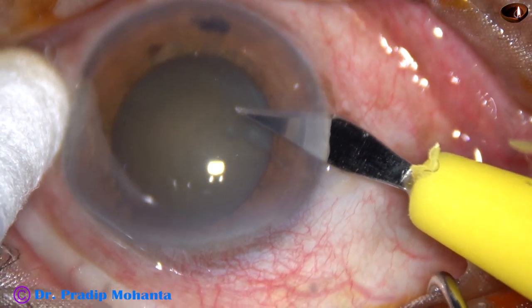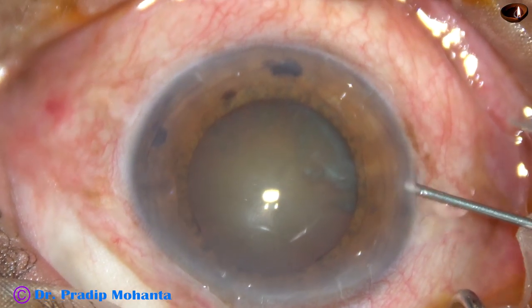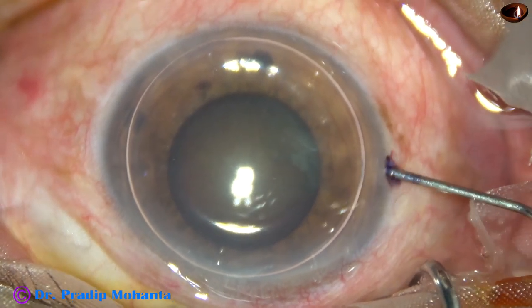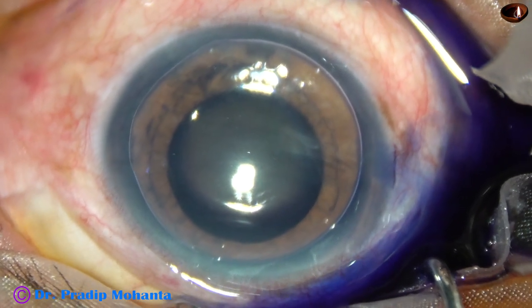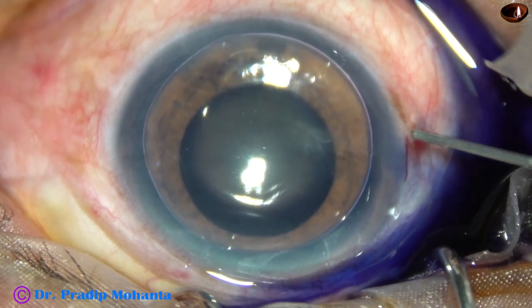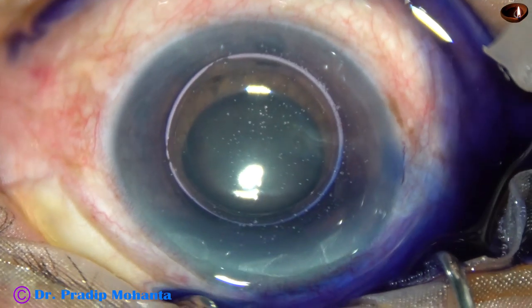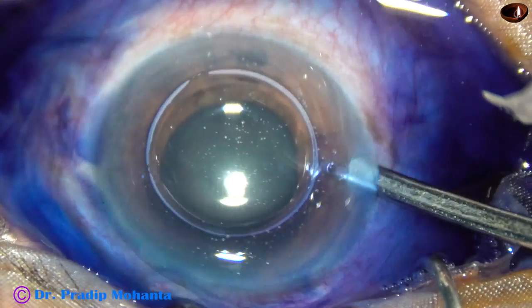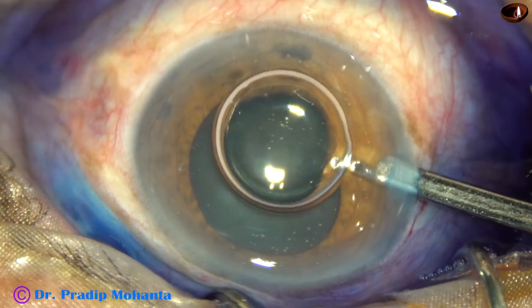This is a stab incision at around 9 o'clock. Now an air bubble is injected into the anterior chamber. Beneath this air bubble, trypan blue 0.06% dye is applied over the anterior capsule of this cataractous lens. Now, this is a bit of diluted adrenaline, applied after dilution. The dye is washed out with BSS.